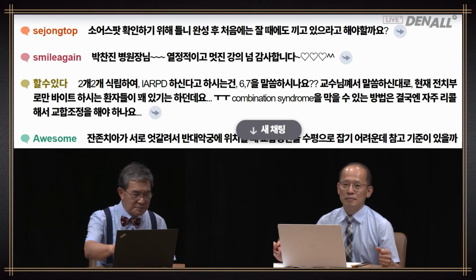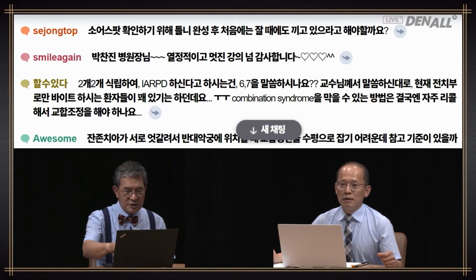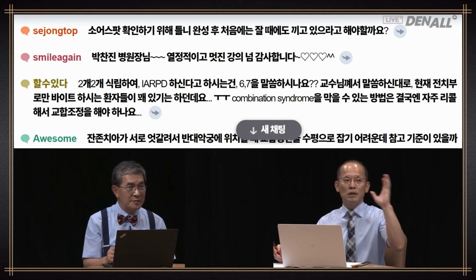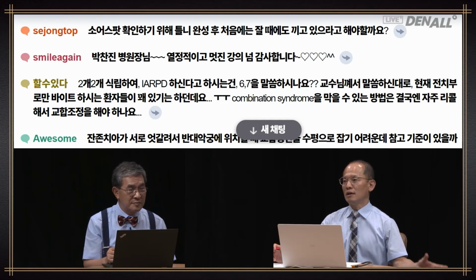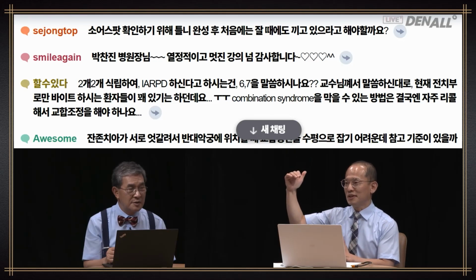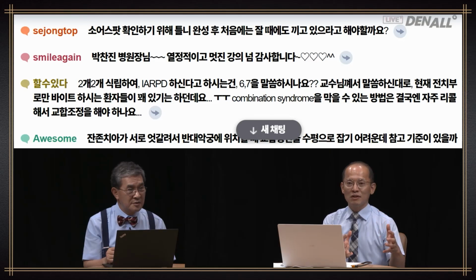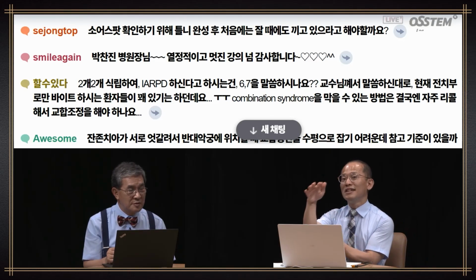And then, to check for sore spots after completing the denture, do you make the patient also wear it during nighttime? No. Well, the environment has changed. So I'd say use the denture that you used before if you feel discomfort. It's about increasing the time gradually. Hence, for the new denture, there's an adaptation period. During that, if you think it's uncomfortable, don't use it.